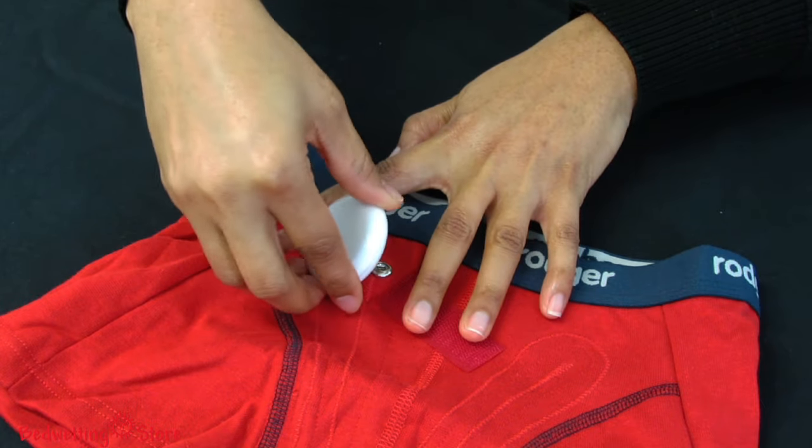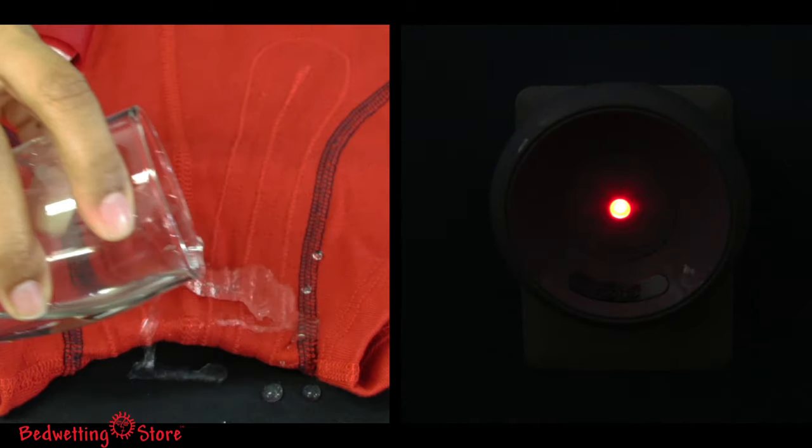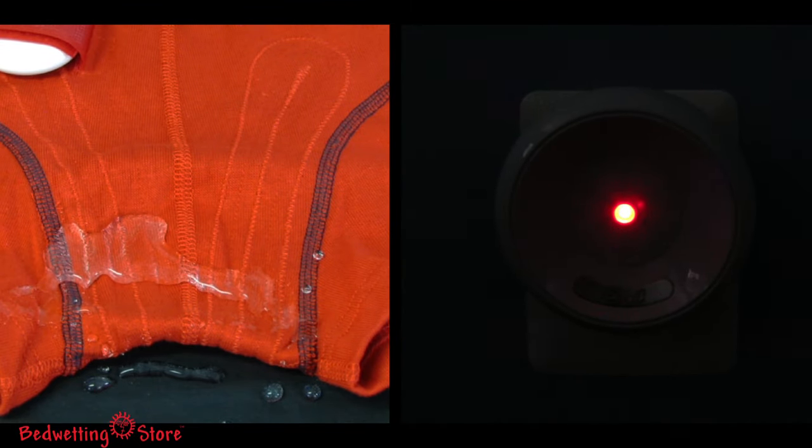Those threads connect to a small transmitter which is snapped to the waist of the briefs. When wetness occurs, a signal is sent to the receiver and the alarm is triggered.